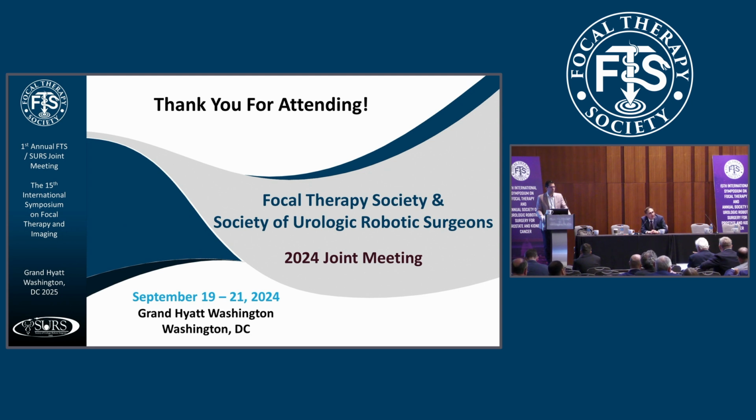Because what you see at a lot of centers is very limited sequences on DCE. Very limited. The whole DCE sequence is only 4 minutes tops, maybe 5. And the only reason people don't want to do it is they don't want to place the IV and pay for the gadolinium because the gadolinium is expensive.